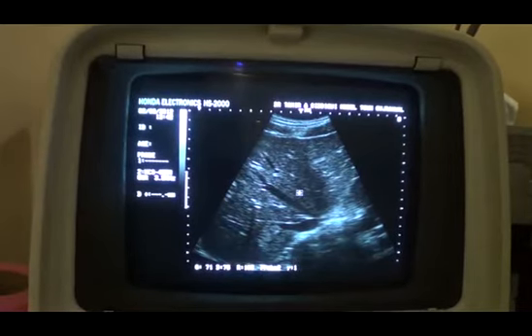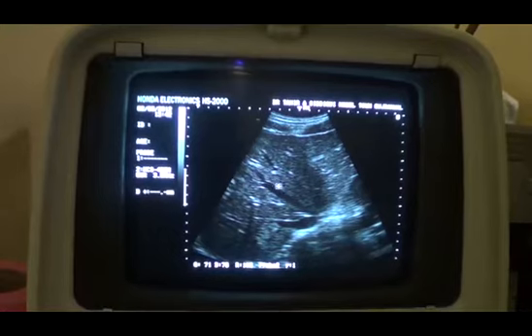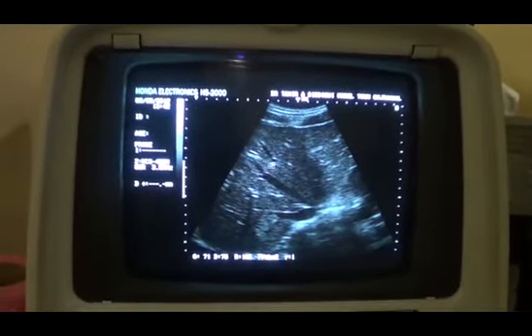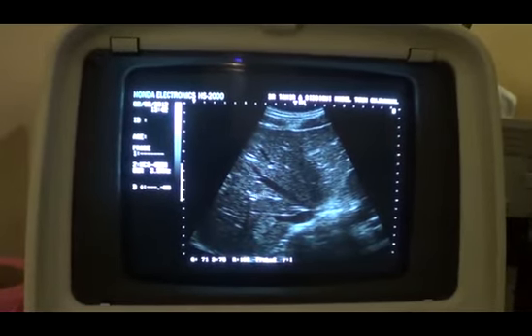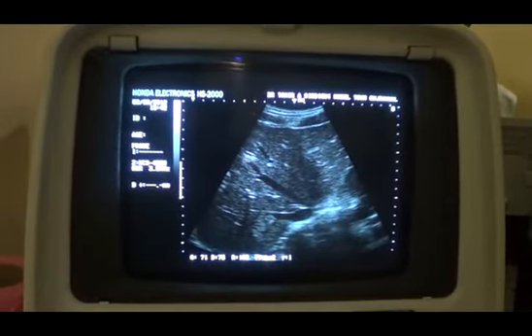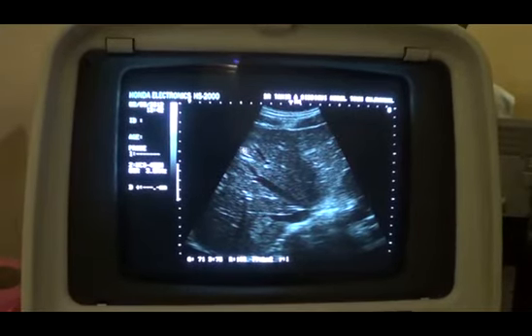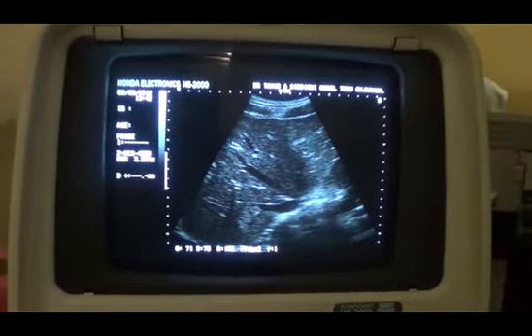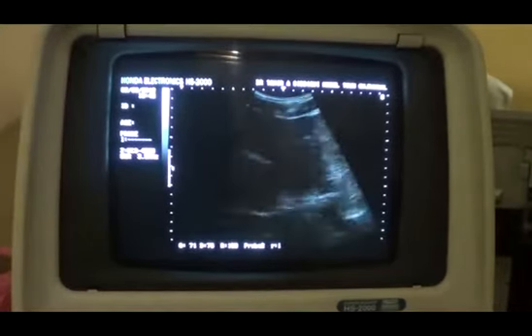This is the right hepatic vein, this is the middle hepatic vein, very sharp edges. This is the IVC, and you see the starry appearance of the minor portal vein radicals. These are all minor portal vein radicals, with a bright star-like appearance because of the decreased echogenicity of the liver and the prominence of the echogenicity of the portal vein radicals.